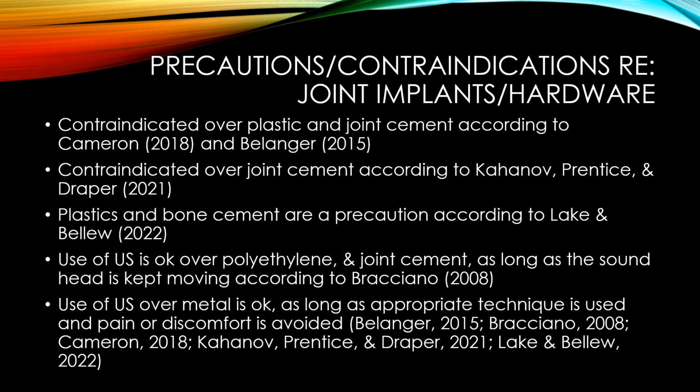Bracciano says that the use of therapeutic ultrasound is okay over plastic and joint cement as long as the sound head is kept moving. So you can see the range of opinion here. It seems that at least 3 of the 5 textbooks say it's contraindicated, certainly over joint cement, and 2 of the 5 say contraindicated over plastic as well. So I would tend to just not do it in that situation.